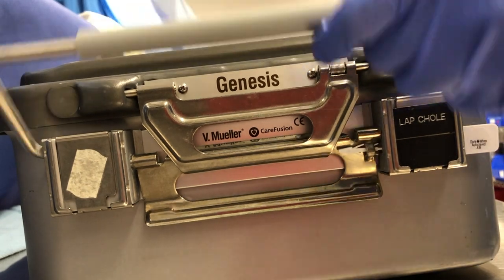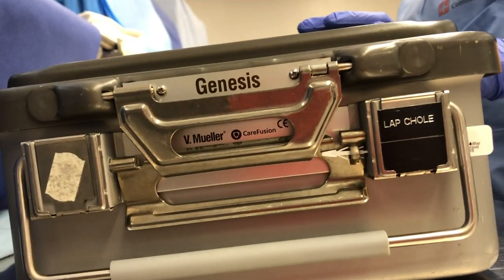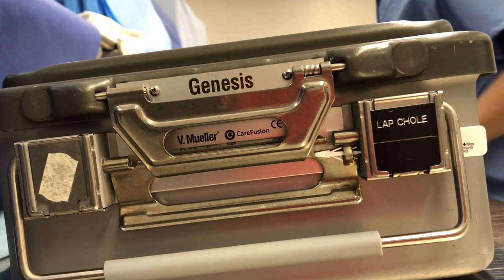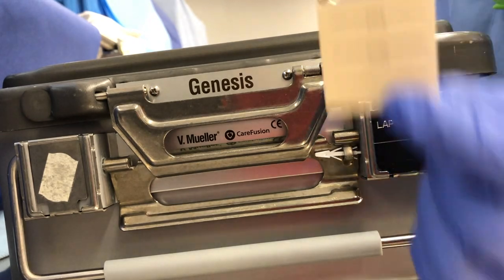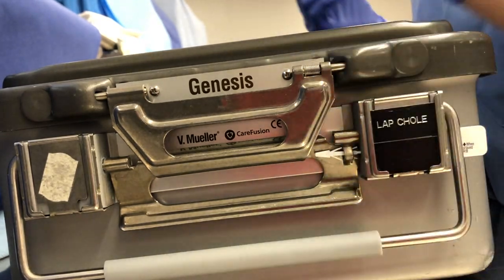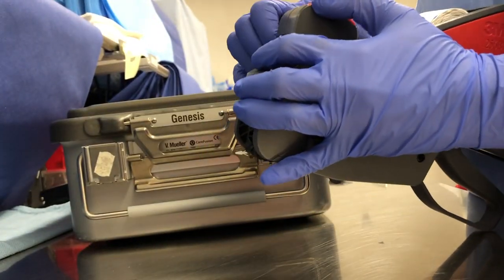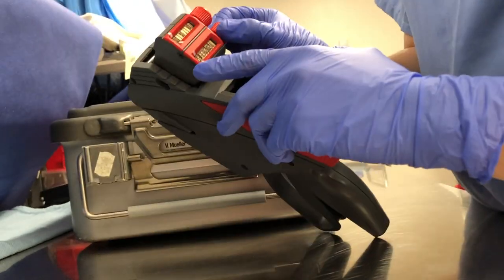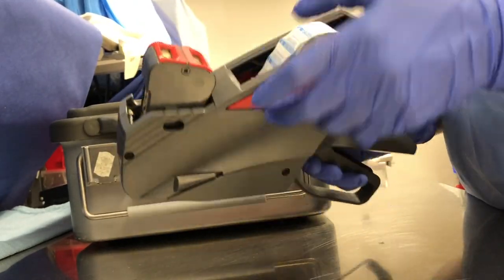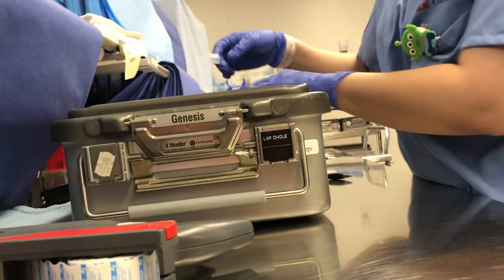That's how you check the sterility of the container on the outside, and of course you double-check it on the inside with the chemical strips. On this data card I'm putting the date, a sticker for the load number — I'm adjusting the sticker gun to have the load number, the sterilizer number, and the date it was sterilized — then I print out a sticker and add it to the data card.